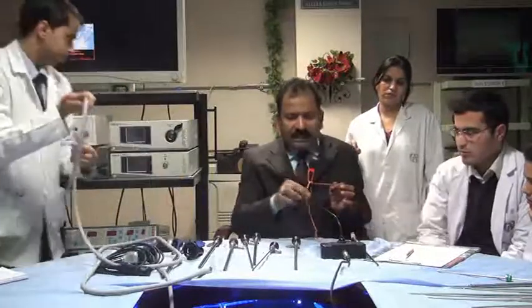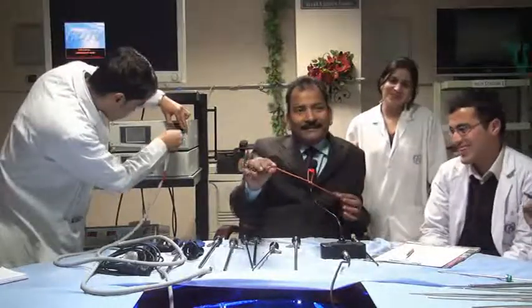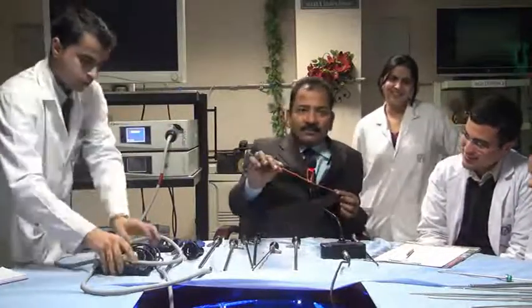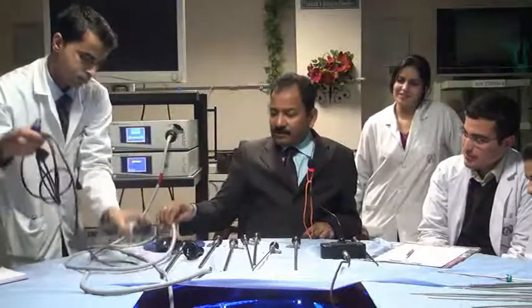This is the common duct and this is the common hepatic duct, going into the liver. Let us assume it. And then you are performing the procedure.